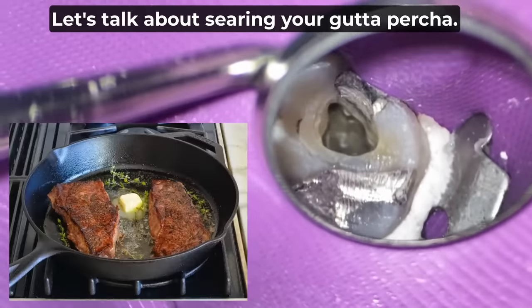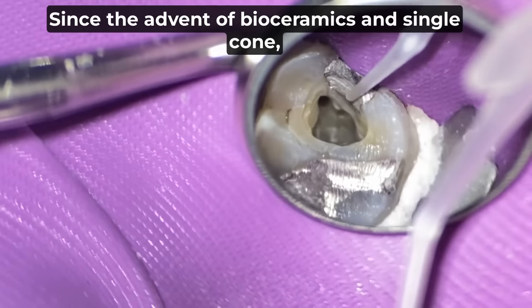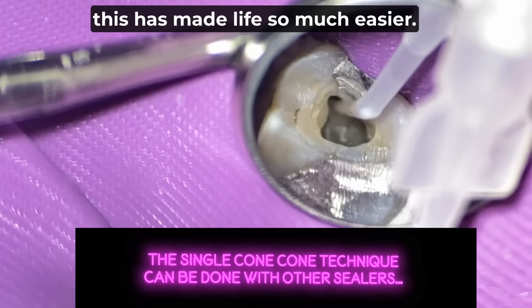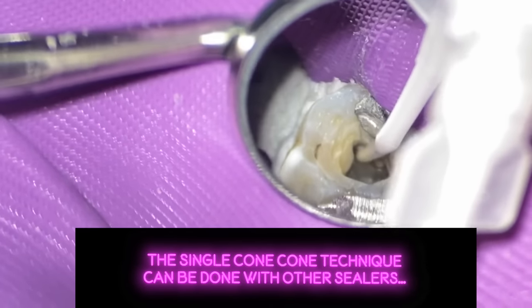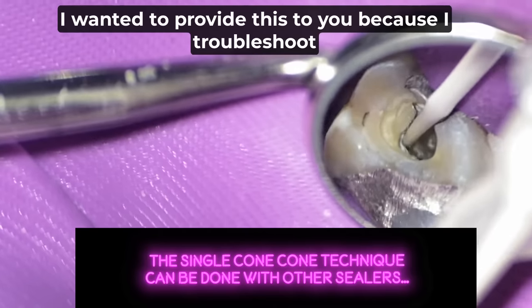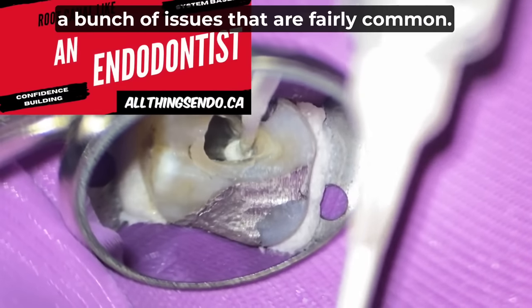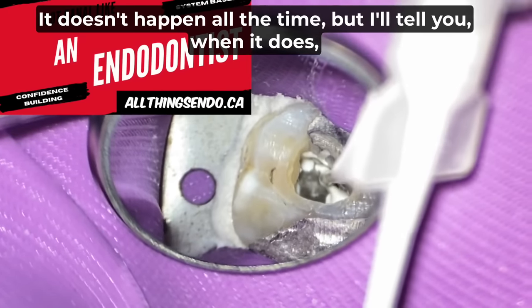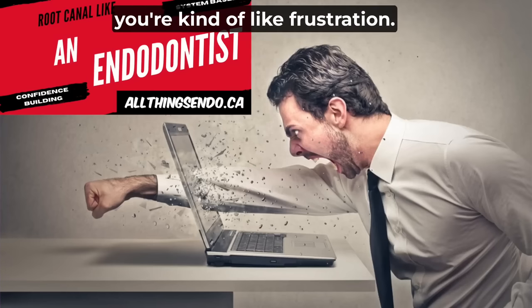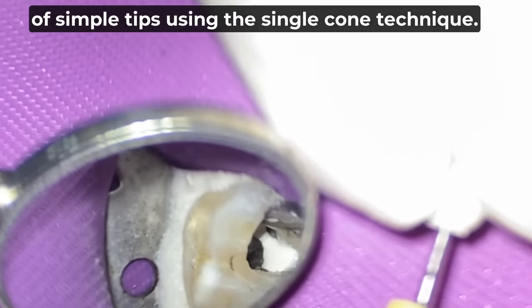Let's talk about searing your gutta percha. Since the advent of bioceramics, going single cone has made life so much easier. But you can still have some problems. In this case specifically, I wanted to troubleshoot a bunch of issues that are fairly common. It doesn't happen all the time, but when it does, it's frustrating. Here we're going to talk about a couple of simple tips using the single cone technique.